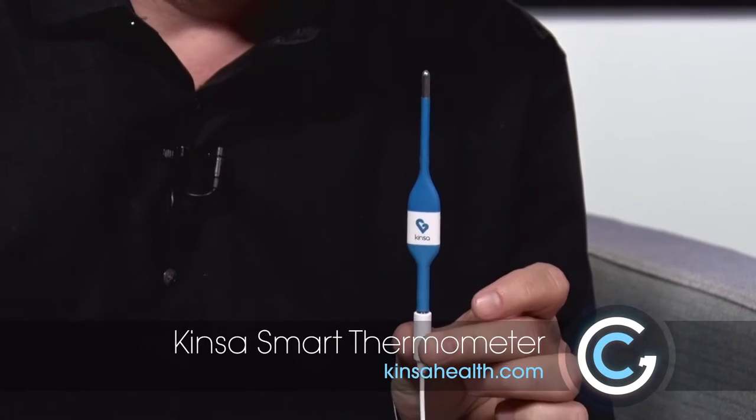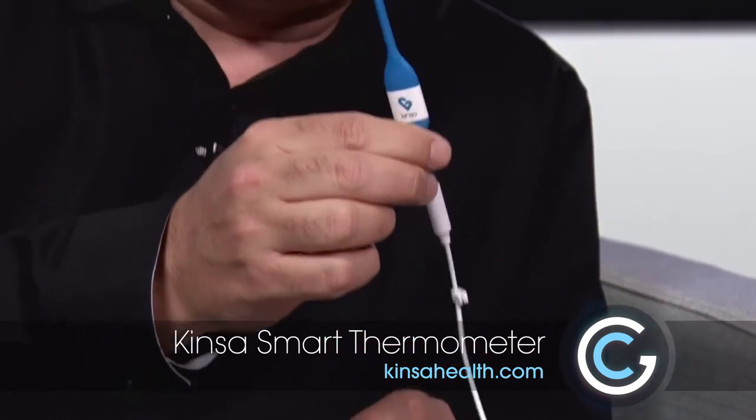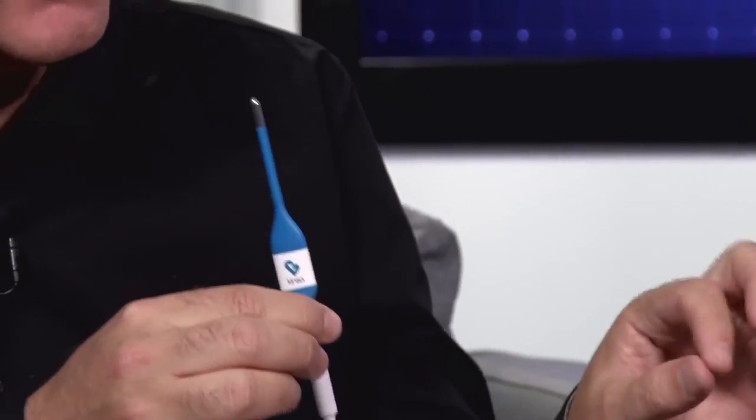Sometimes I wish technology could make me smarter, but we're seeing it in all sorts of devices now. This is something kind of cool — it's from Kinsa, it's a smart thermometer. It works in conjunction with the thermometer part, but then it ties right into your smartphone to give you a specific temperature reading, and you can get temperature from all sorts of different ways.